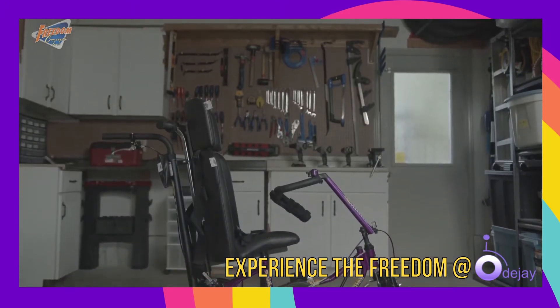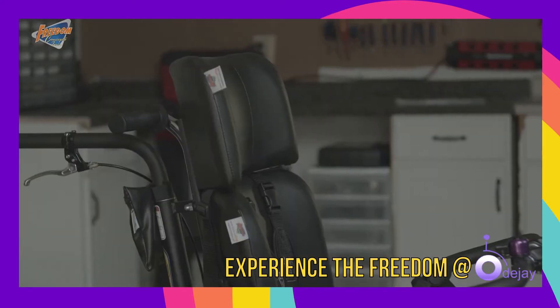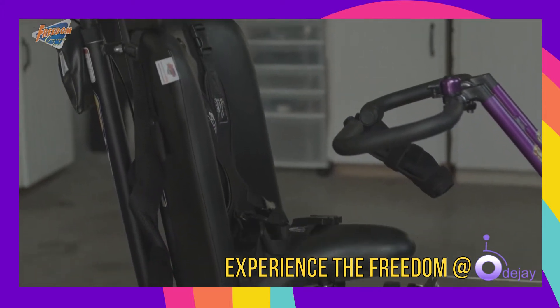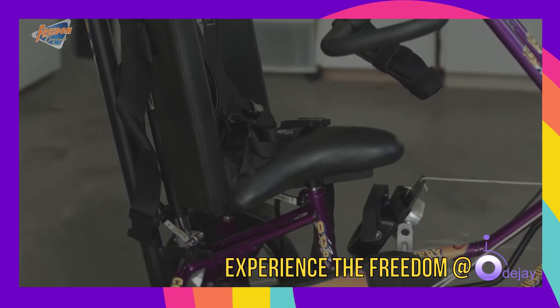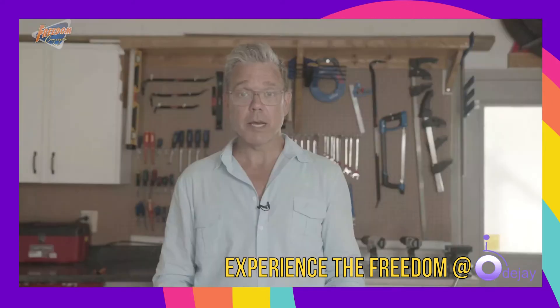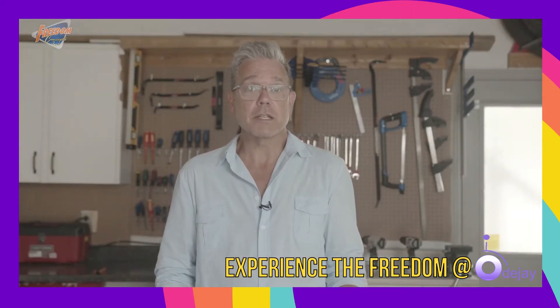We will be going over their features, adjustments, clinical applications, and how to accommodate the needs of anyone who wants to ride, regardless of their level of ability. The Discovery series is our most popular model of adaptive bicycle. It comes in three sizes to accommodate riders as young as 18 months old, all the way up to 14 years of age.